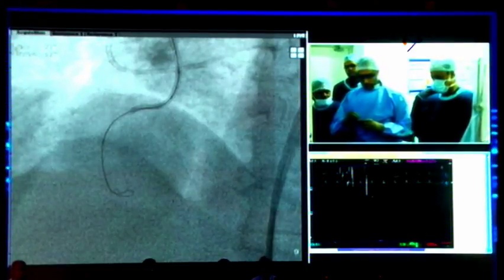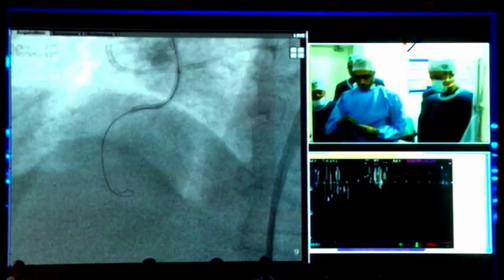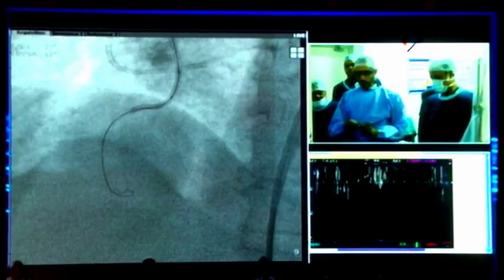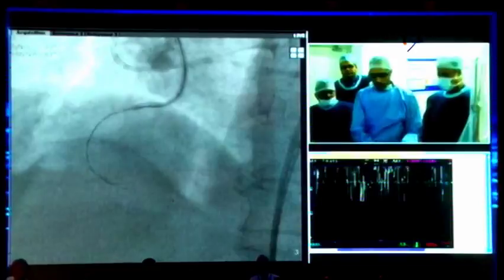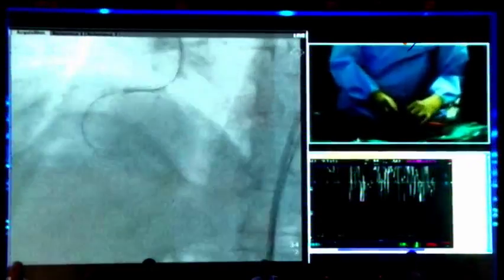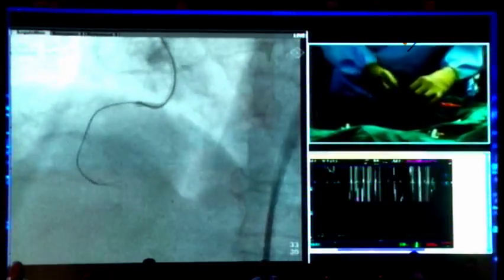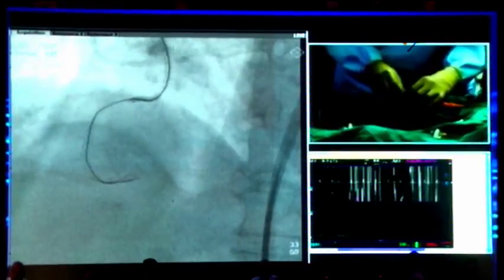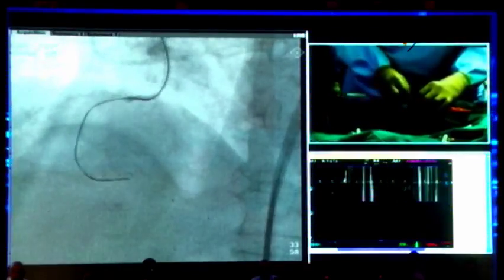Can the cameraman show your hands when you're actually bossing it? We want to see the movement, how you do it. Sure. Okay guys, camera. I'm now just loading it on the wire, so you don't want to see that. Okay, good. Camera on hands. So can you tell us what exactly you'll be doing when you boss it? You'll turn clockwise or anticlockwise? You can do either and spin. The key is to go fast. So you can see my hands. You push, rotate anticlockwise? I don't push. You've got to spin fast. Okay. Yeah, you don't want to push.